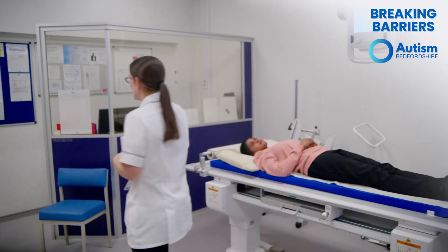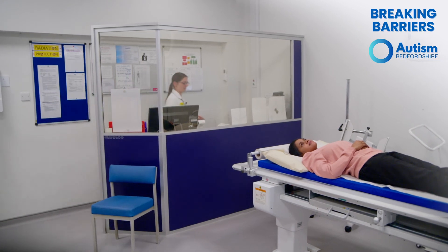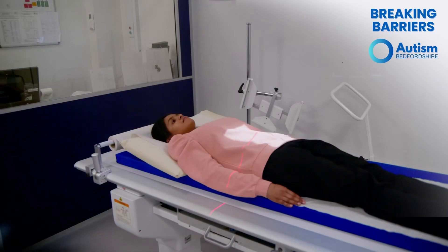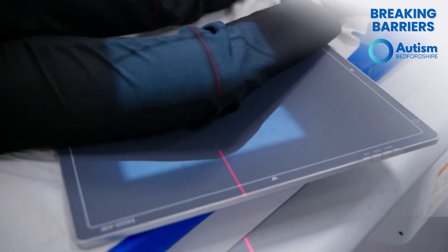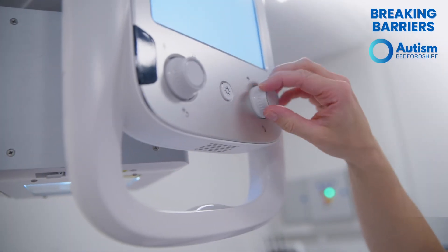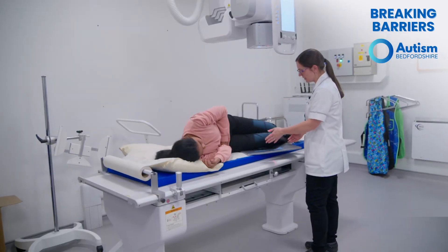While the x-ray is being taken, the radiographer will go and stand behind a screen. You need to keep as still as possible while having your x-ray taken — this only takes a few seconds. Sometimes you will need more than one x-ray, and sometimes the radiographer may need to repeat the x-ray. This is nothing to worry about and may be because they need to change your position slightly or move the x-ray tube.